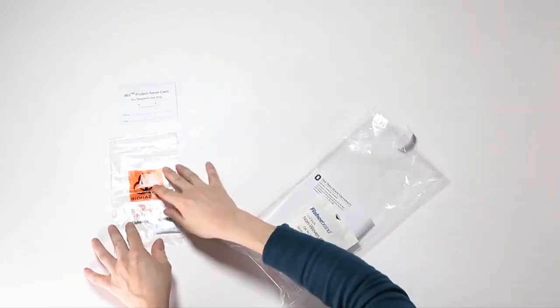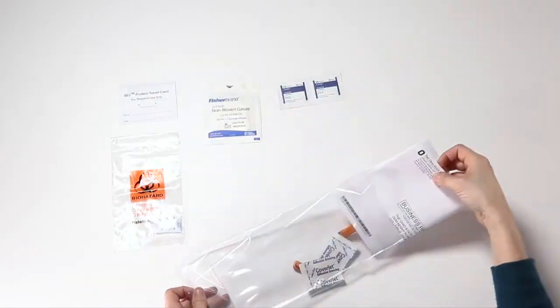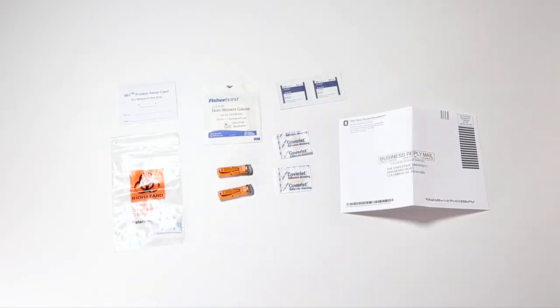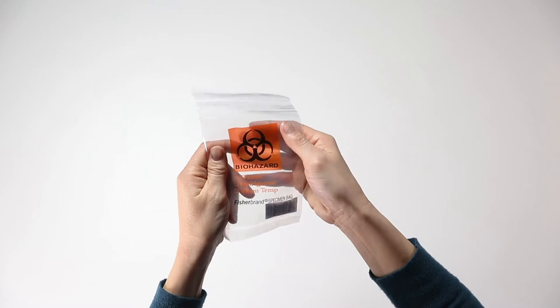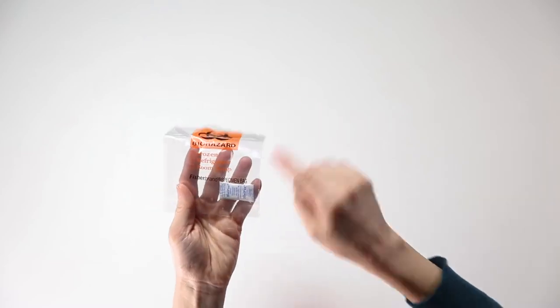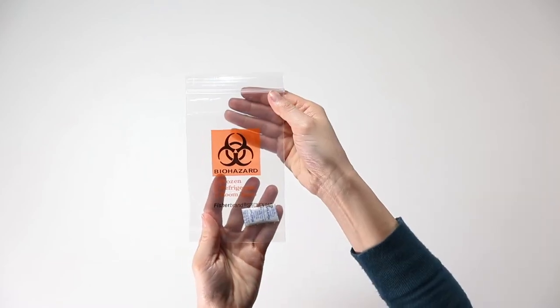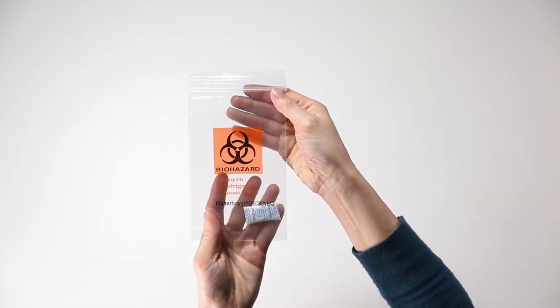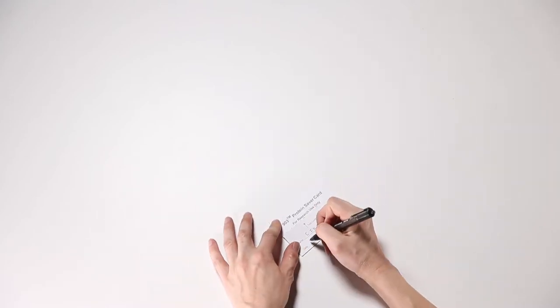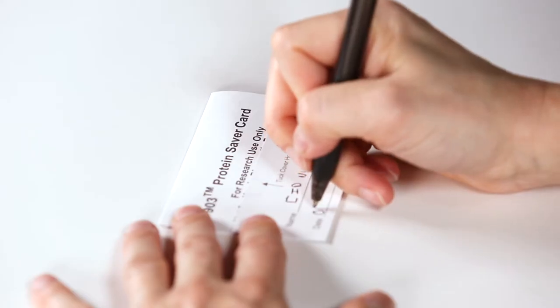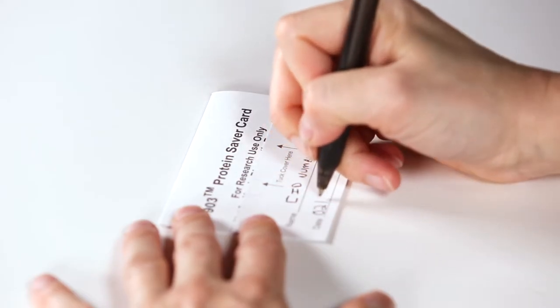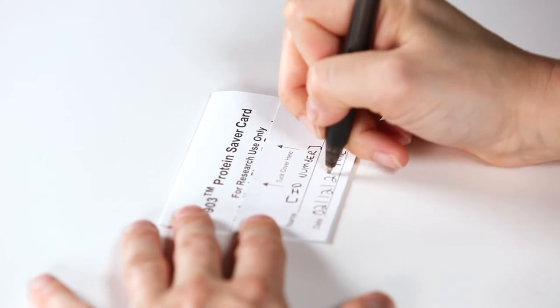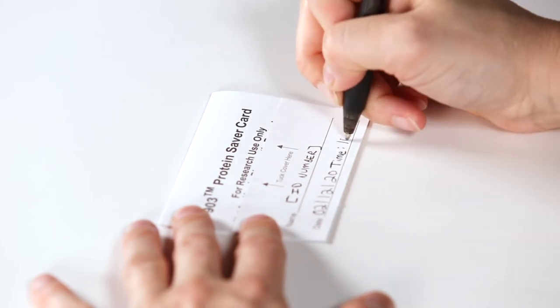Open your kit and lay everything out on a flat surface. Leave the bag of silica gel, which absorbs moisture, in the biohazard bag. Write the date and time on the front of the collection card. Do not write your name here. There is a unique code on the card used in place of your name.